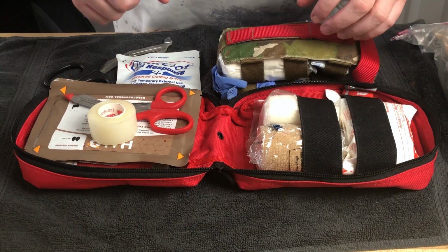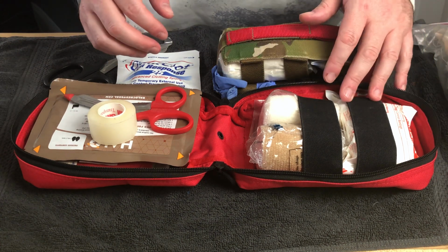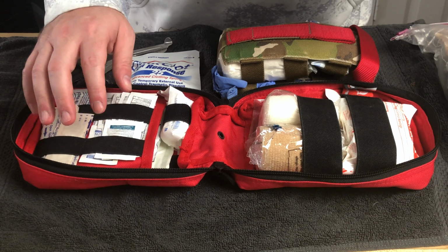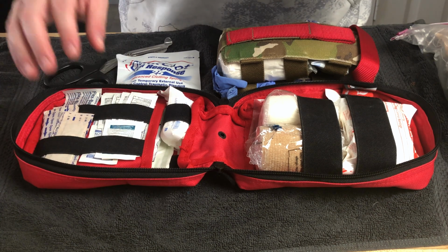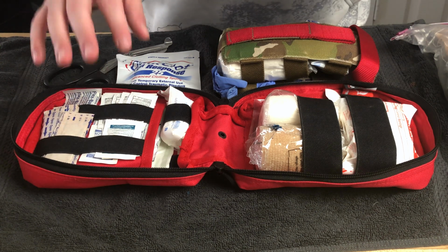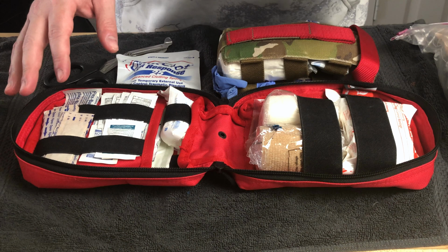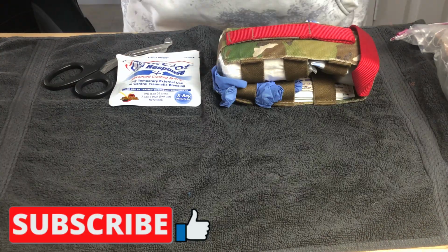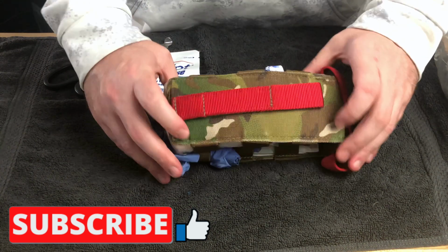Notice how big it is. It is the biggest of the kits I'm going to show you. There's enough here for a long weekend of somebody being miserable, okay? Allergy meds, things like that. There's literally enough here that if somebody's just having a bad weekend, something is not going right for them, we're okay. It's under control. Then you get to one that is a little more oh shit oriented.